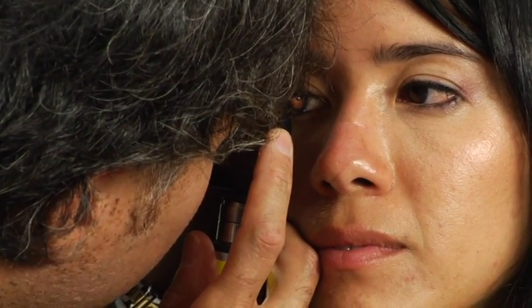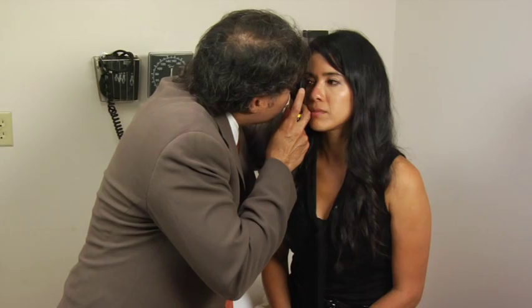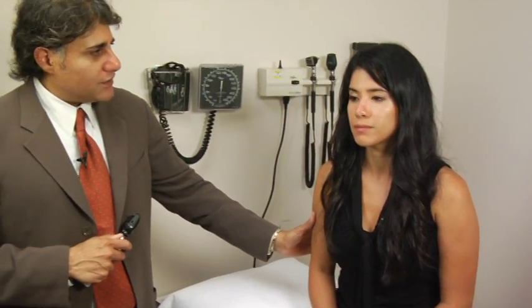For example, if this is a patient with diabetes, you might see some yellow exudates or cotton wool spots indicating diabetic retinopathy. Very good, Dr. Zhao. Completely normal examination. Thank you very much.